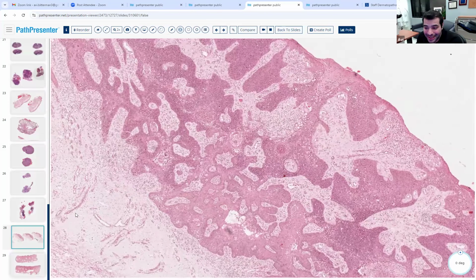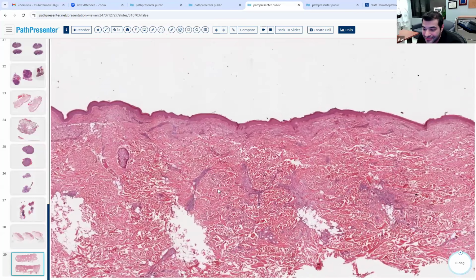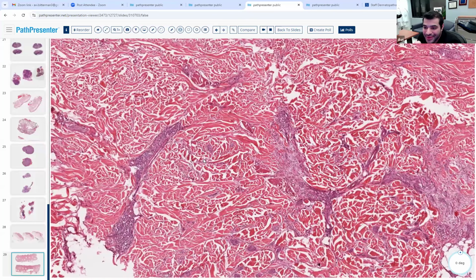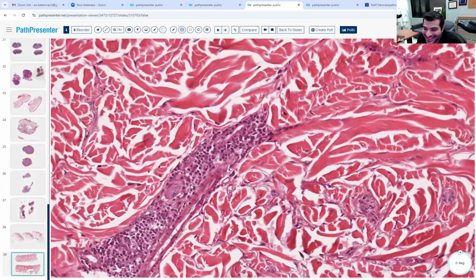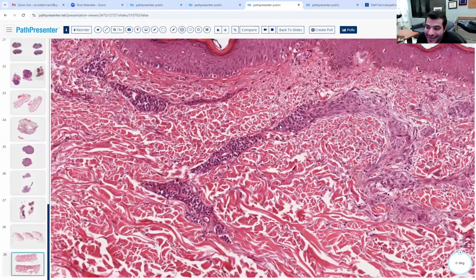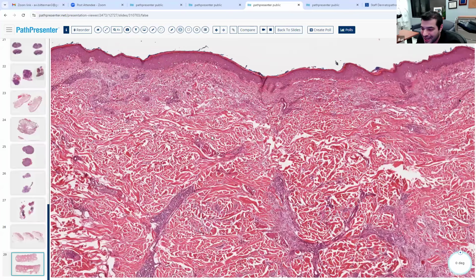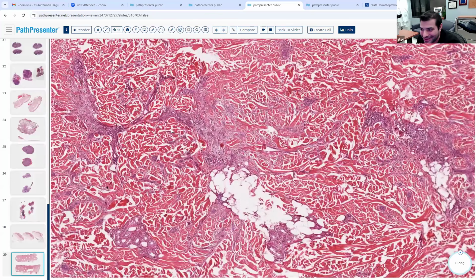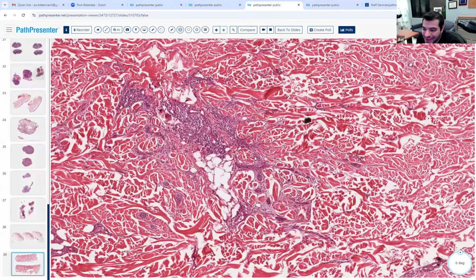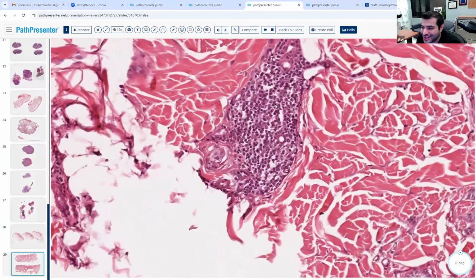But yes, good. You guys are doing great. I think we're on our last one. I don't think they're actually going to ask you for an example like this. We probably won't do this one, because I've never seen it asked like this, but this was supposed to be a sclerosing sweat duct carcinoma, which I'm not even sure is all that distinct from a MAC. You can see the strands of cells here, but they typically ask a more obvious example. So we'll treat the last one as our last case, but you can see the ducts over here.